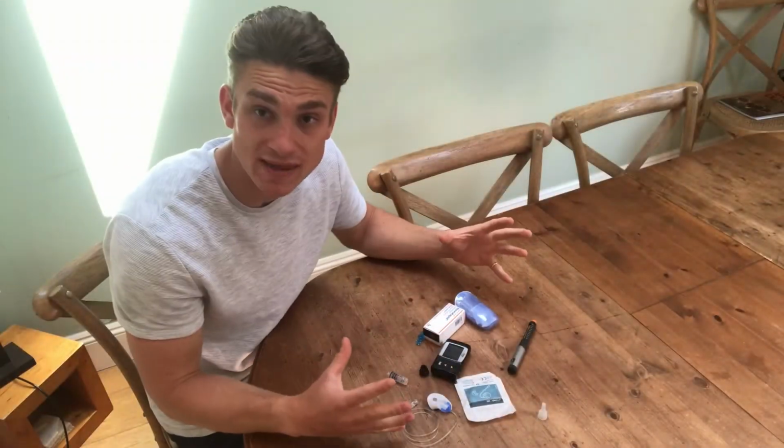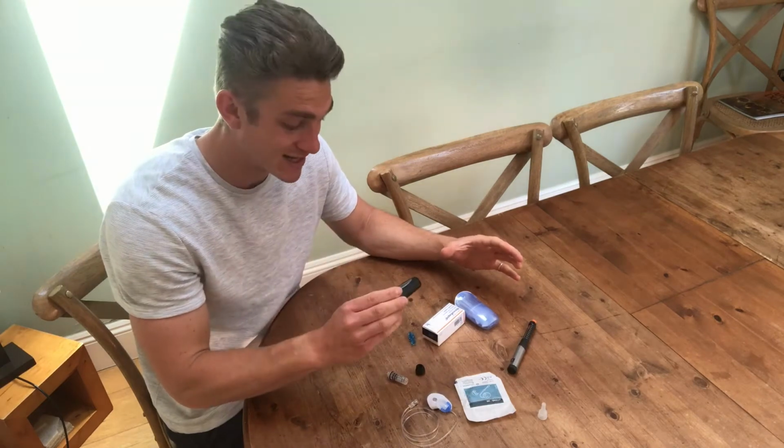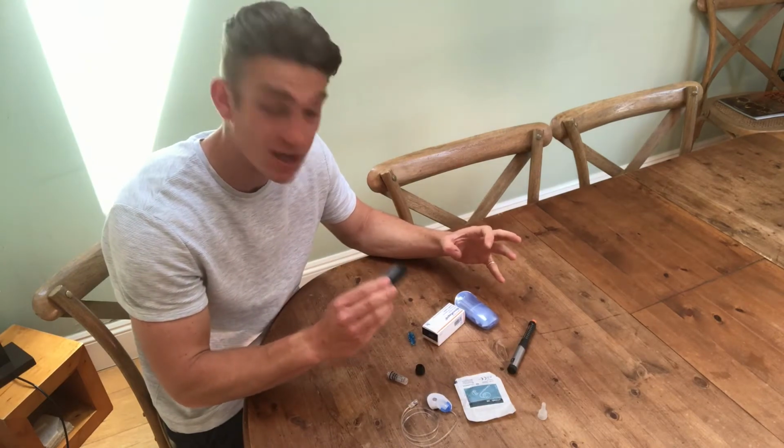Hey, I hope you enjoyed the introduction to the video. I'm now going to take you through the change of my pump because today is the day of change. So this is all the kit that I need to change my pump. It's going off right now, it's telling me, George, you haven't changed me, change me.